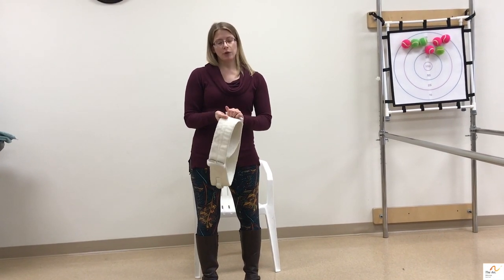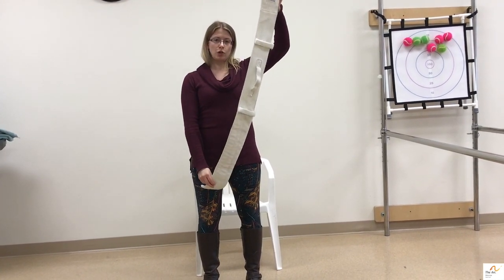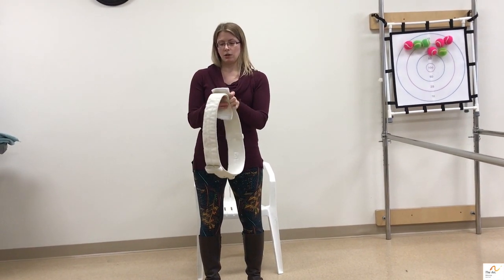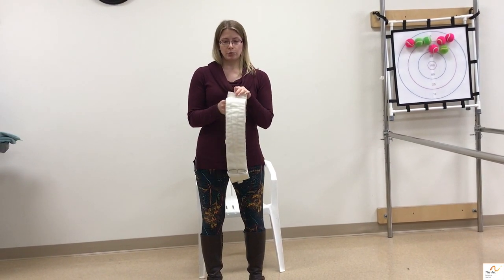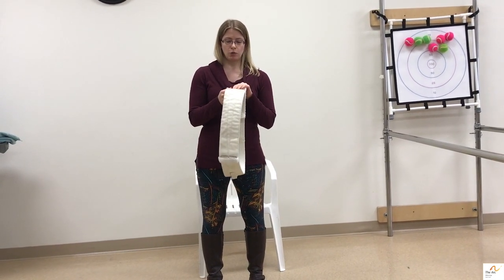In terms of caring for a gait belt, they can be washed in cold water and hung up to dry. But when you're washing a gait belt, make sure that you have the velcro attached. Otherwise, lint and debris can get stuck inside and then it won't be able to attach securely in the future.